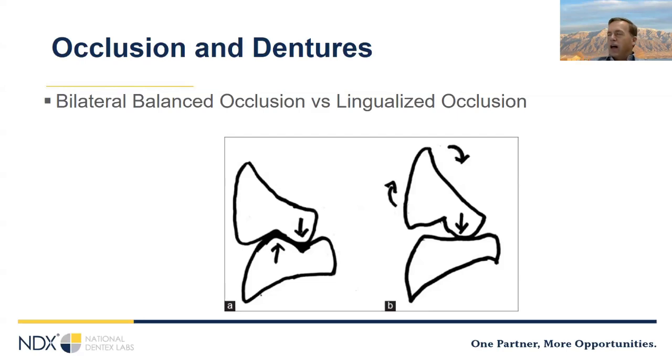Lingualized occlusion has gotten a lot more popular in recent years. That's the image on the right here, B.